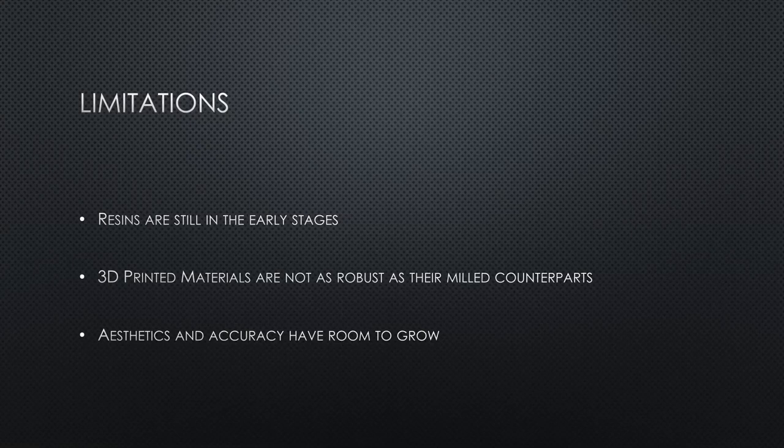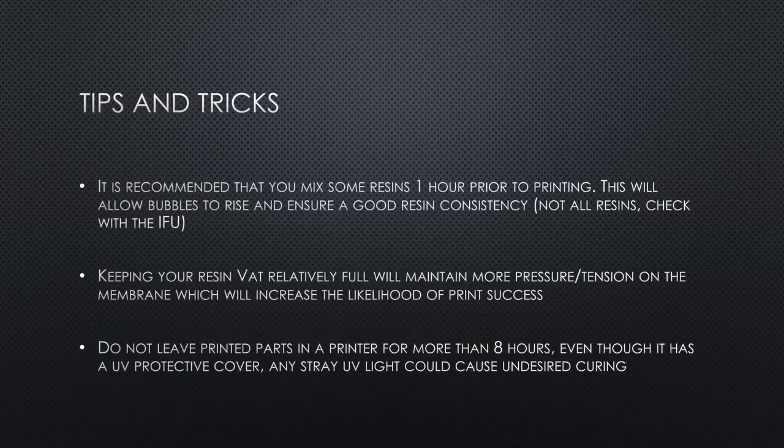So moving on to some tips and tricks. For certain resins, it's recommended that you mix them 1 hour prior to printing. Agitate and shake up the material really well and set it aside for an hour so that bubbles can rise and you ensure a good resin consistency, so you have a very nice, clean, and clear print. This isn't for all resins, so make sure you check the instructions for use of your specific resins.